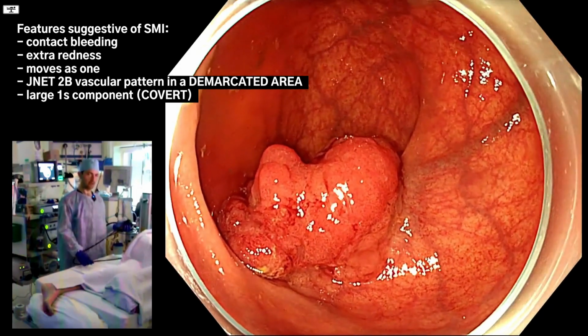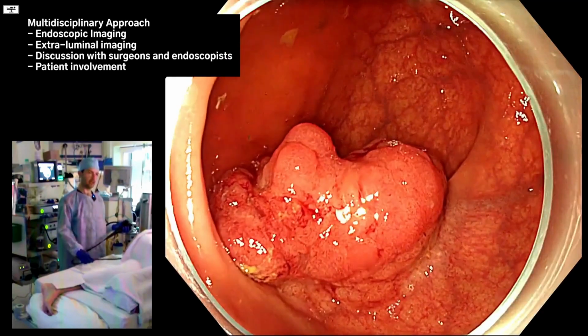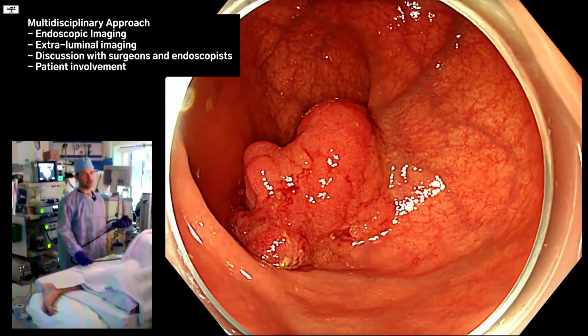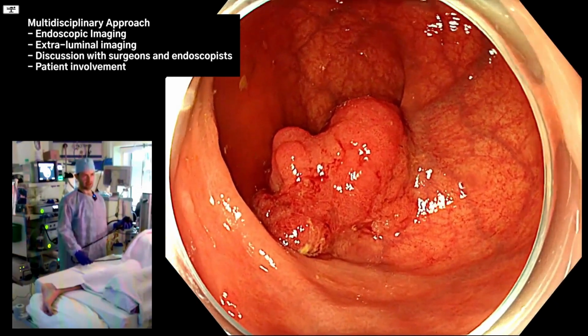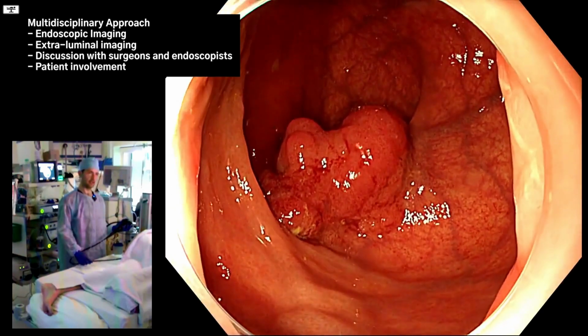Here you really have to think about a multidisciplinary approach, including some form of imaging to assess lymph node status. And here we've done that, we've done an MRI, the lymph nodes are negative, so we're going to proceed with a potentially curative endoscopic submucosal dissection for this patient.